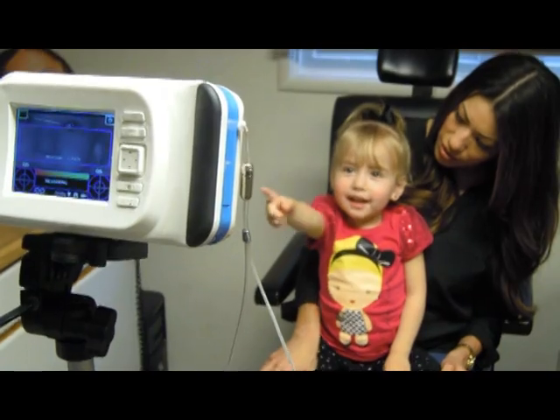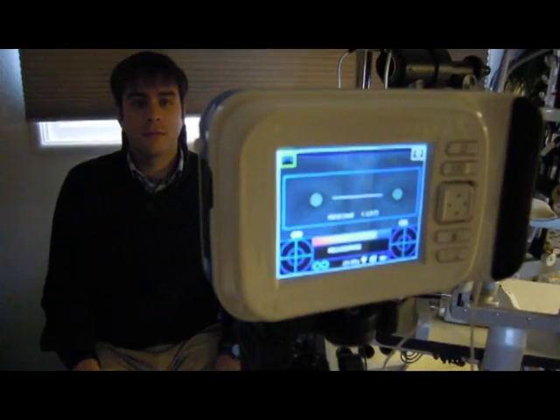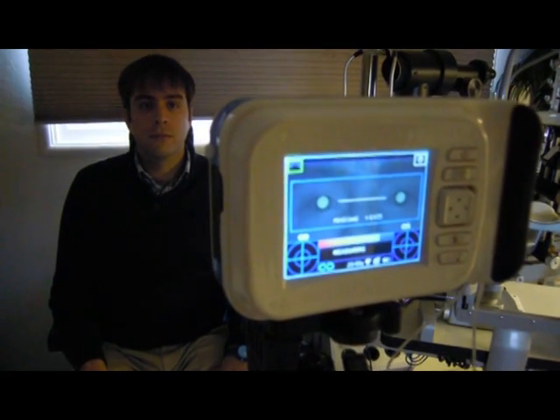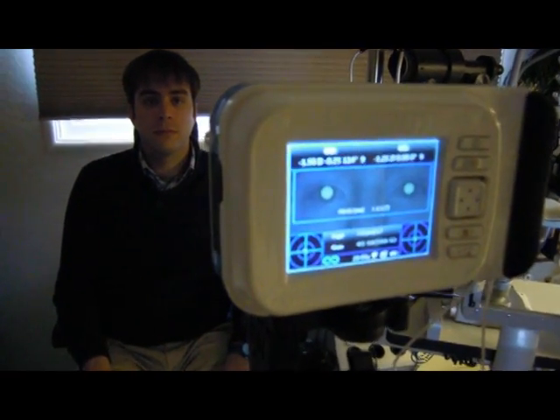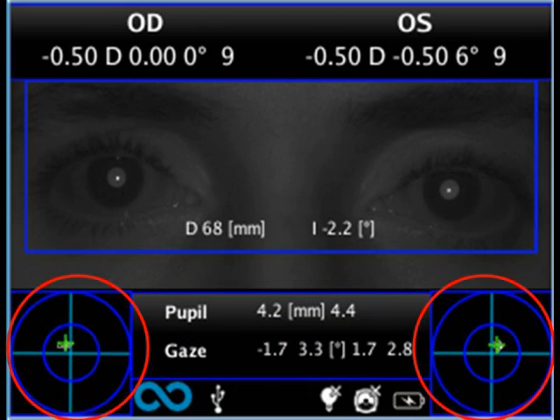Now release the start button and the 2-WIN automatically displays the measurements on the screen within approximately 2 seconds. It's that simple. The top part of the screen shows sphere, cylinder, and axis of both eyes, as well as a reliability index, which indicates how reliable the measurement is. You also have pupil distance, pupil size, alignment of the eyes, and fixation.